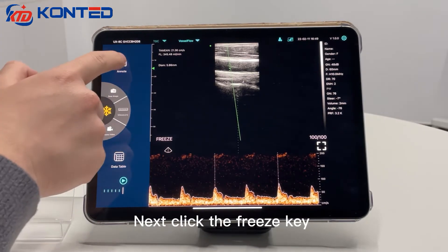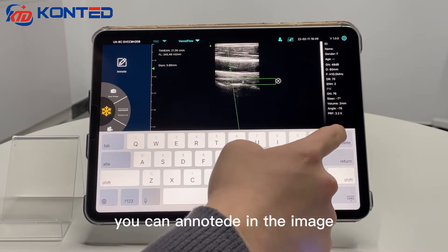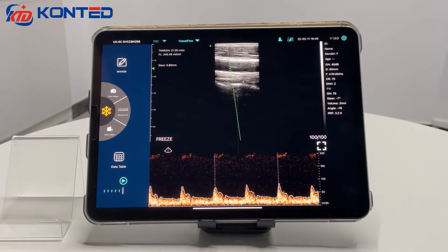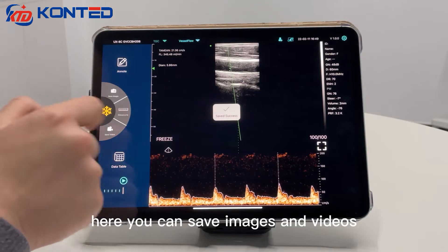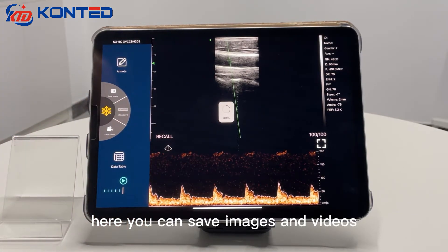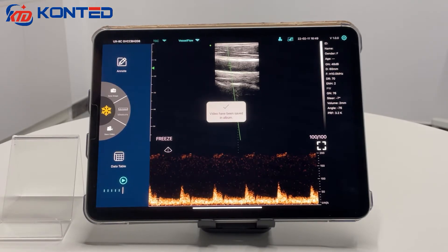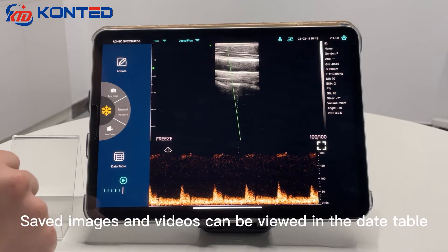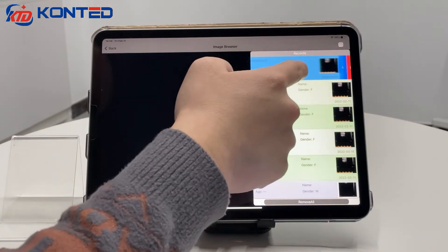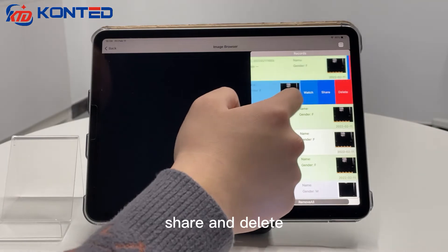Click the freeze key. This is the annotation function — you can add annotations to the image. Here you can save images and videos. Saved images and videos can be viewed in the data table. Swipe left to watch, share, and delete.